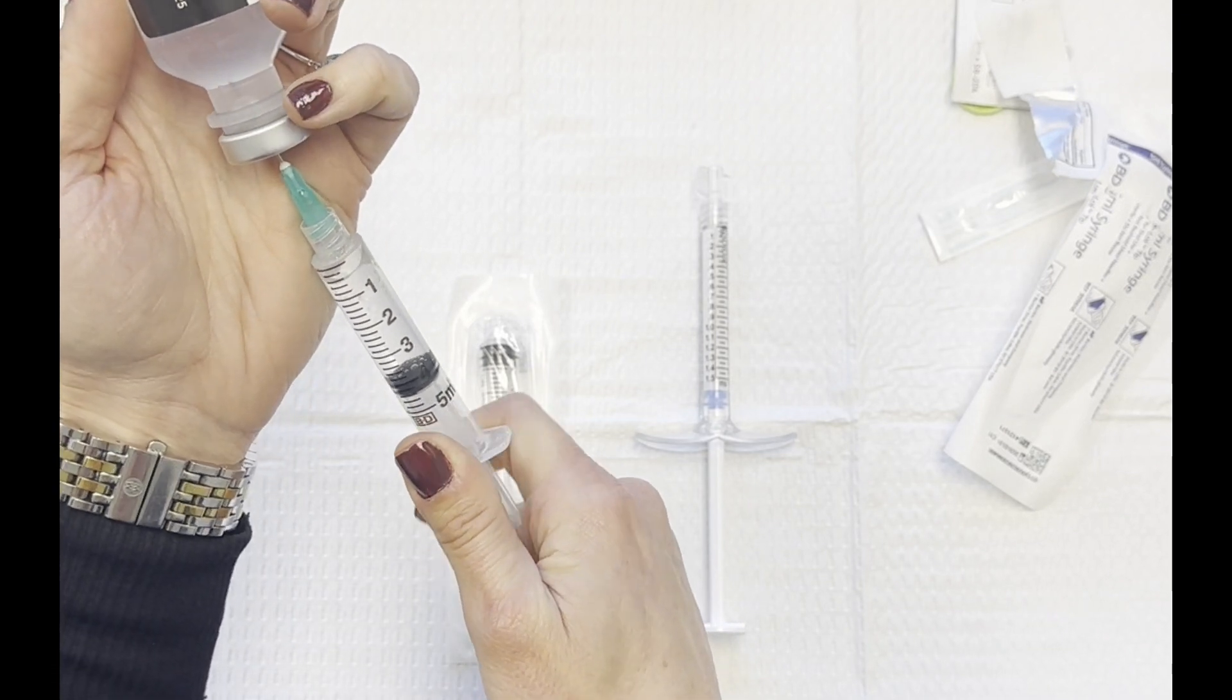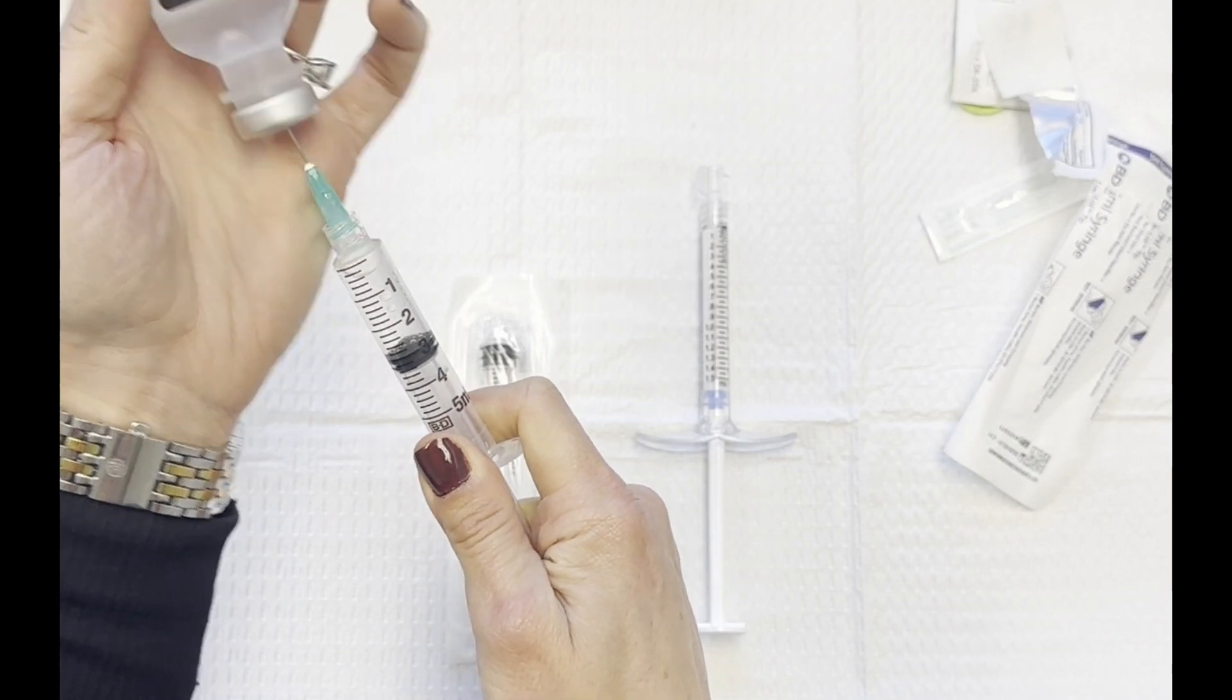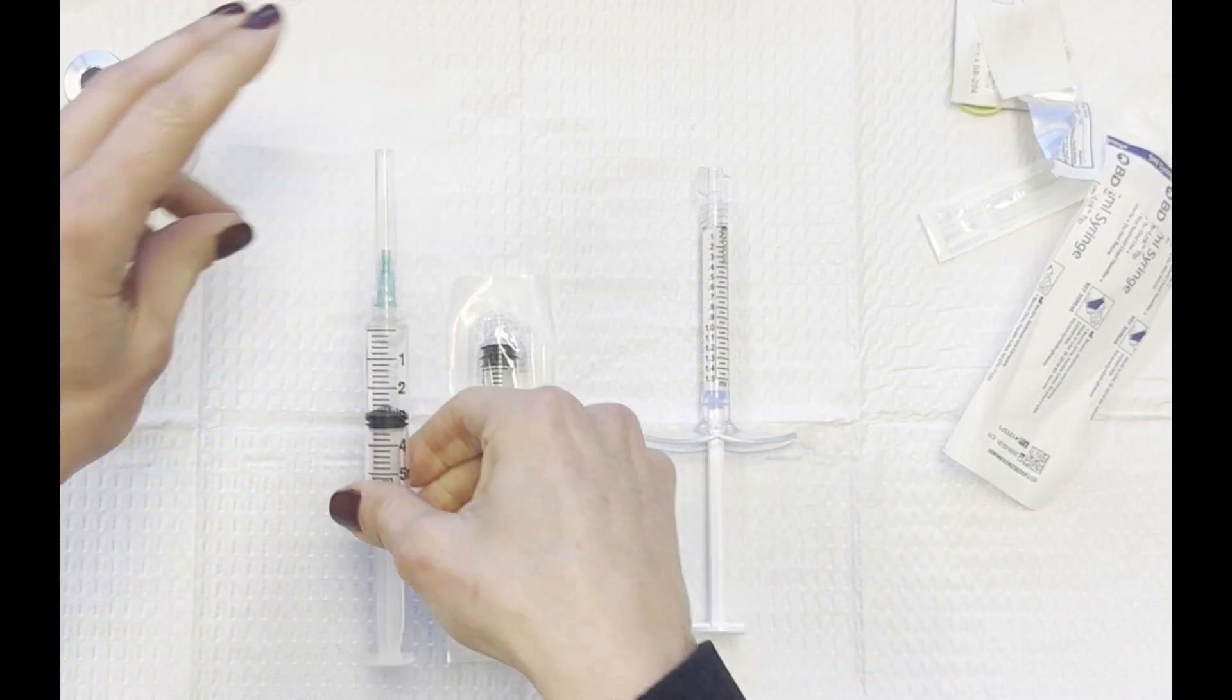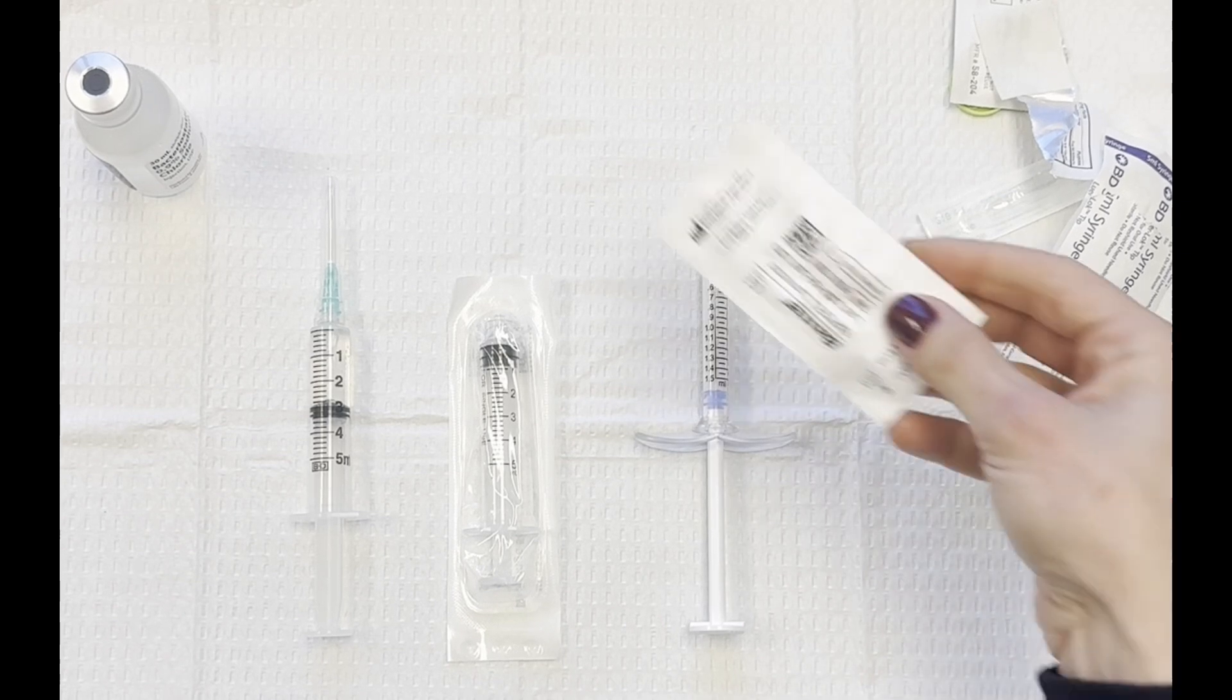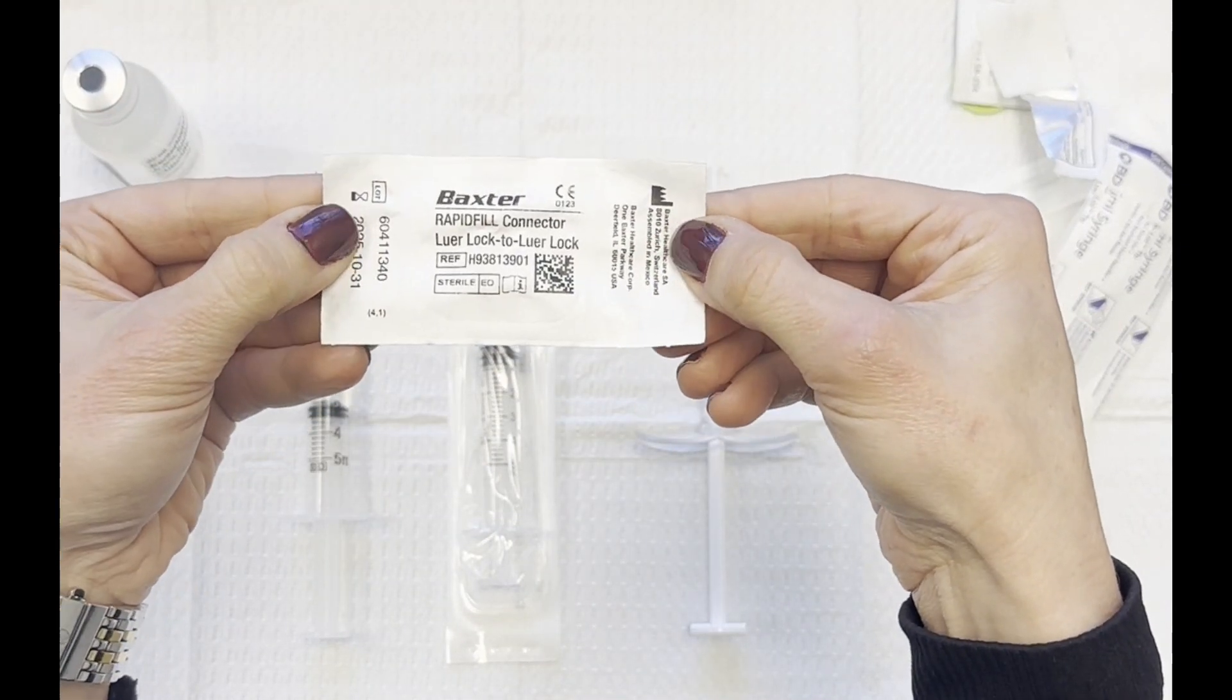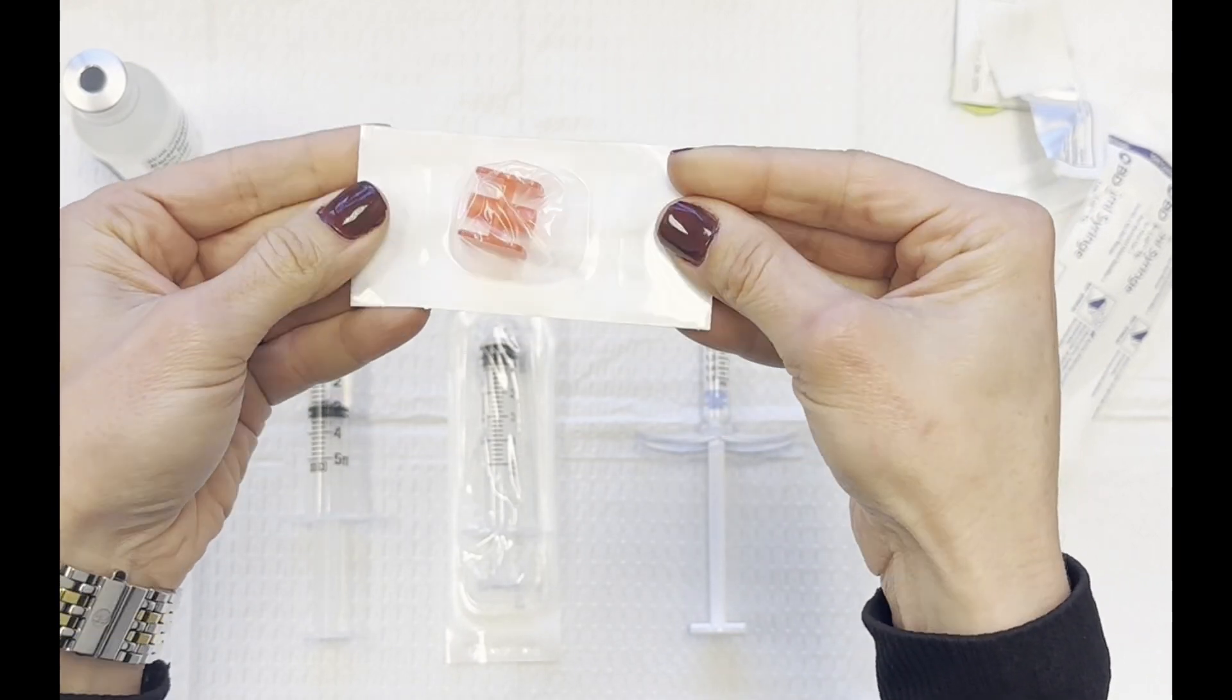And then I'm going to grab my Luer Lock, and these Luer Locks can be purchased directly from MERS, or you can get them separate. They're very cheap. So grab my little Mixer Luer Lock.